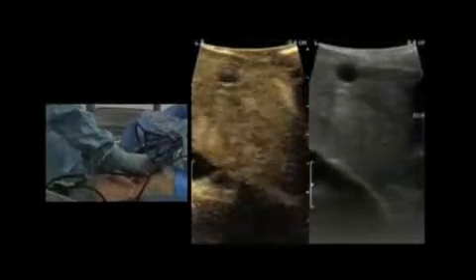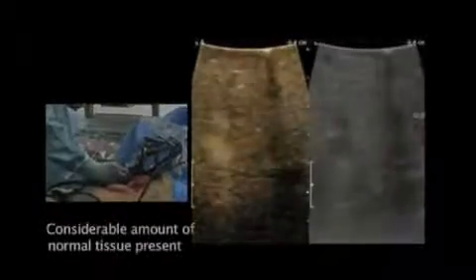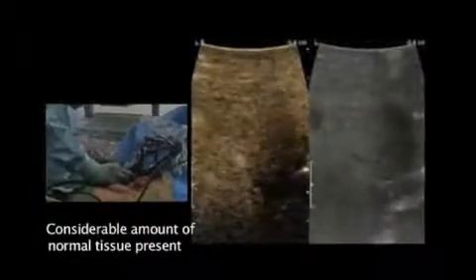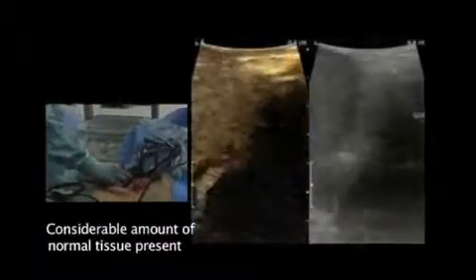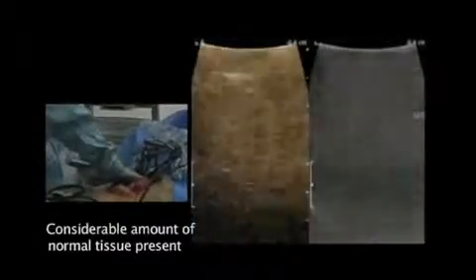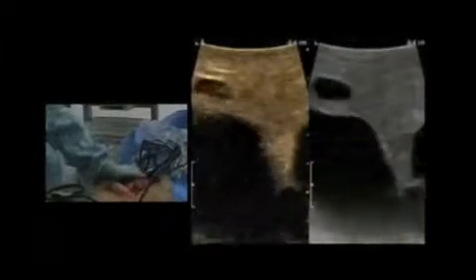Let us go around and see on the smaller cysts, and if they should hide any solid structures in between in the liver. And there's a considerable amount of wealthy, normal looking tissue or liver parenchyma, which is good for the patient's prognosis.